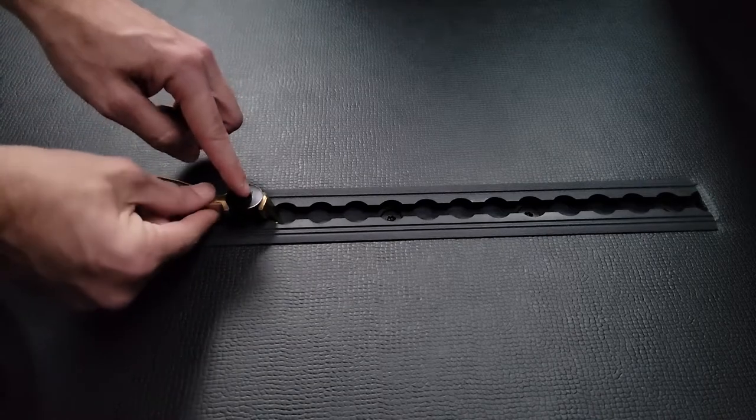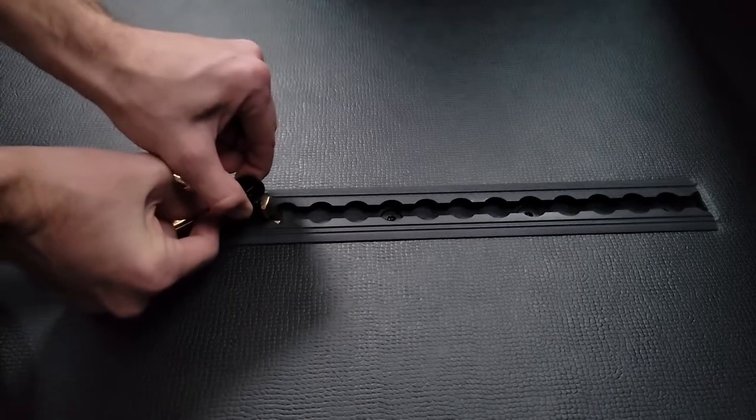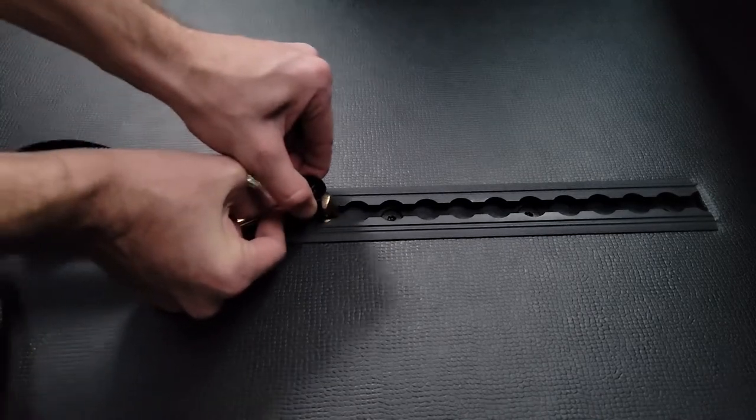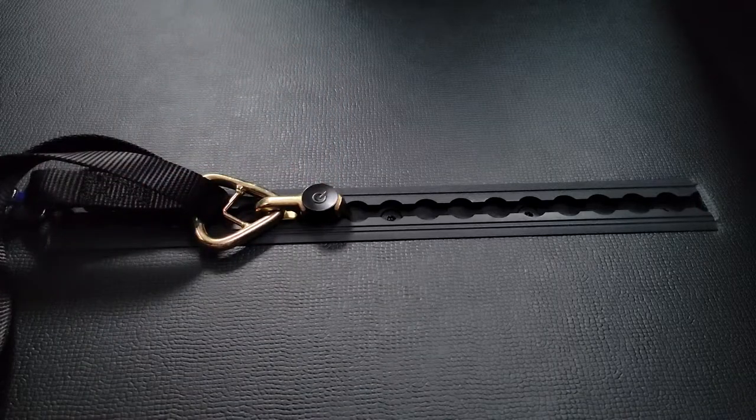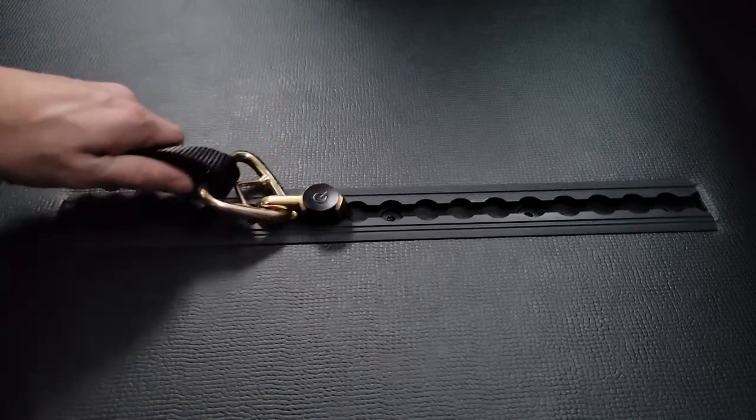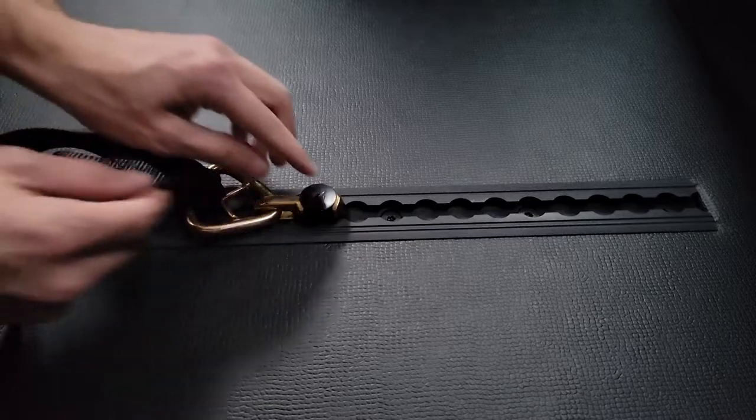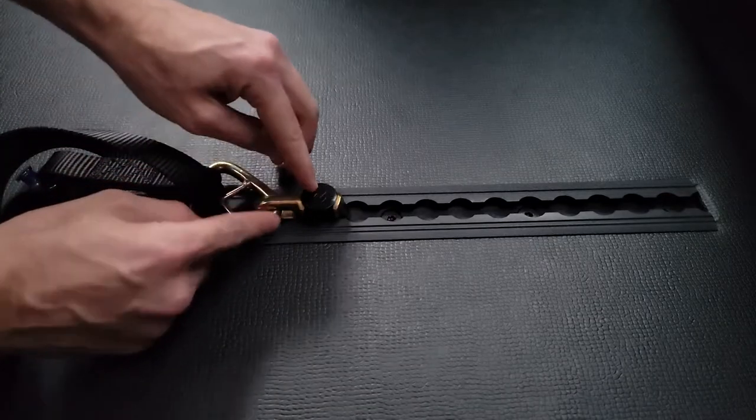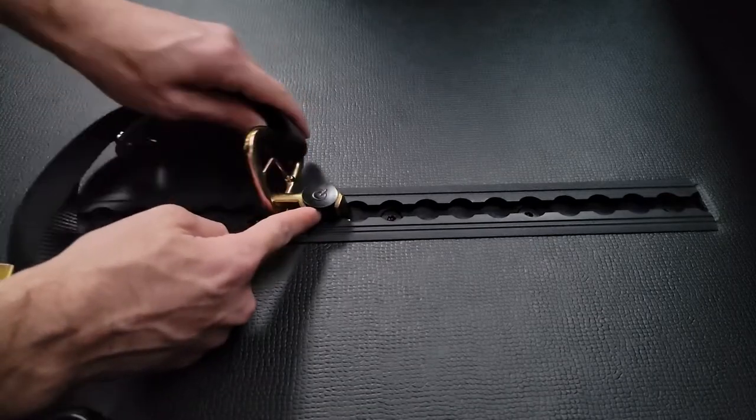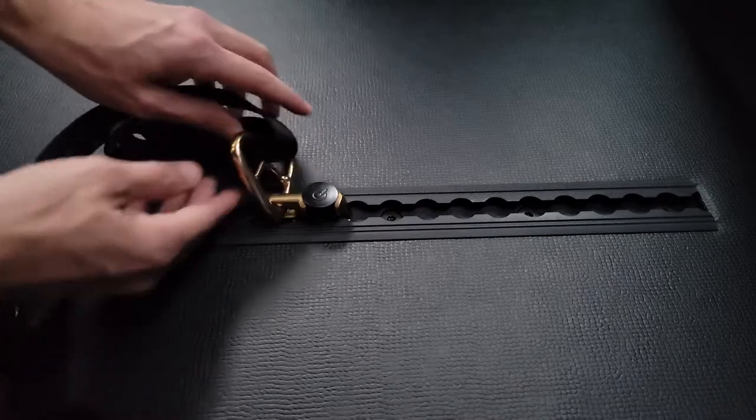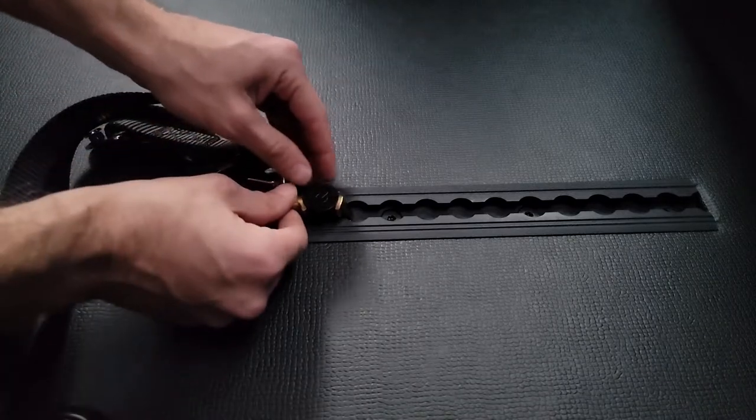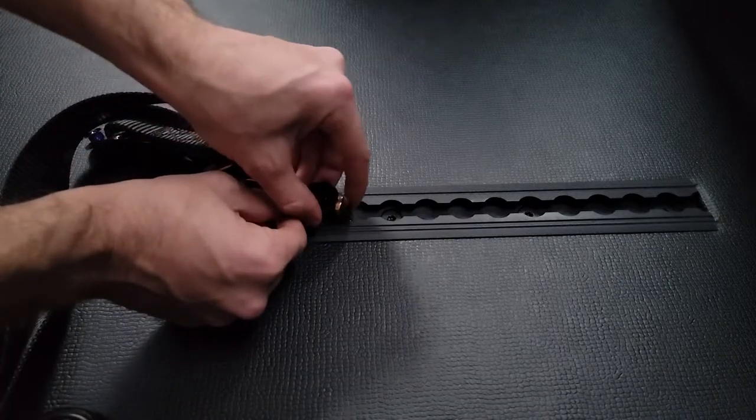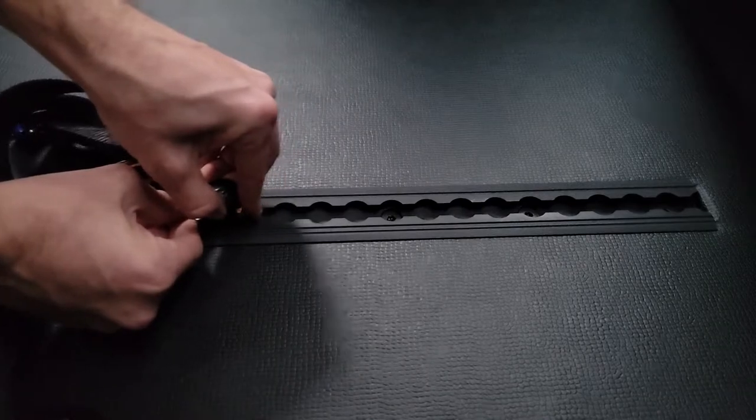So we're going to go ahead and push and lift, and we're going to slide it over. Again, if you want to move it from here to back here, you're simply going to push and lift, slide it back, release.